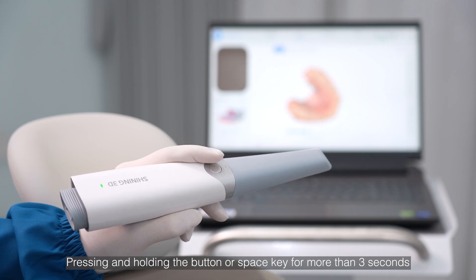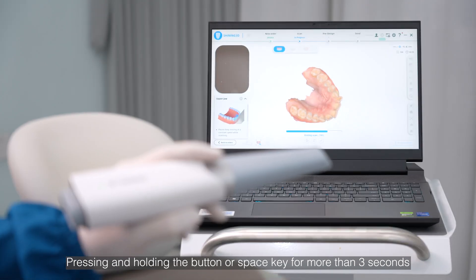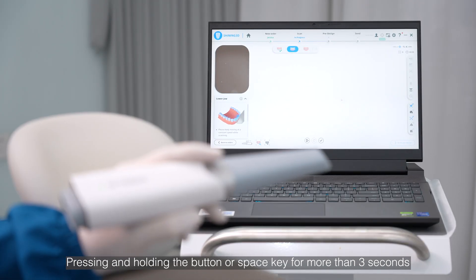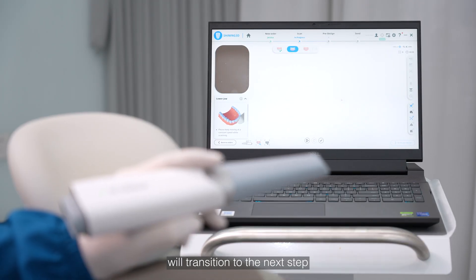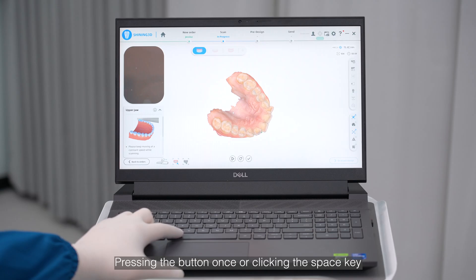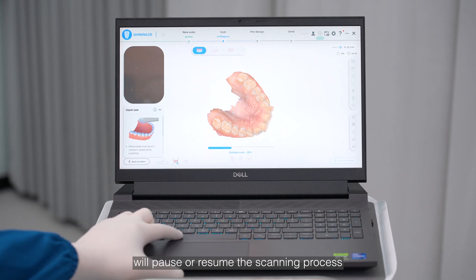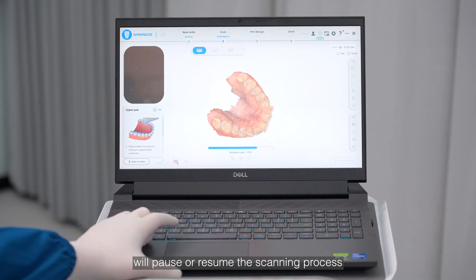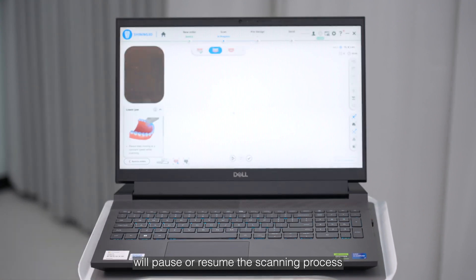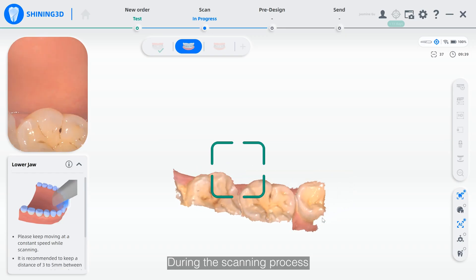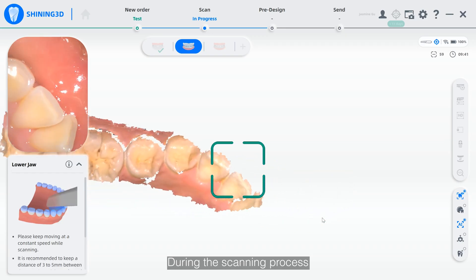Pressing and holding the button or space key for more than three seconds will transition to the next step. Pressing the button once or clicking the space key will pause or resume the scanning process.